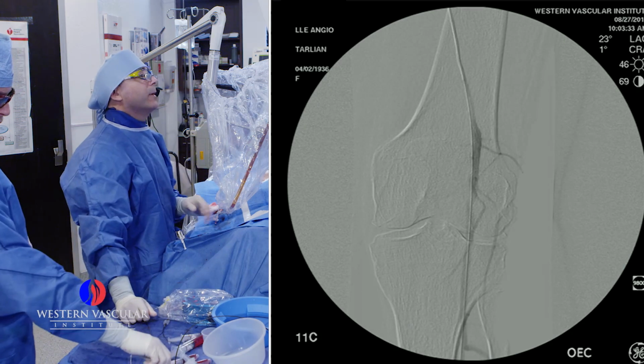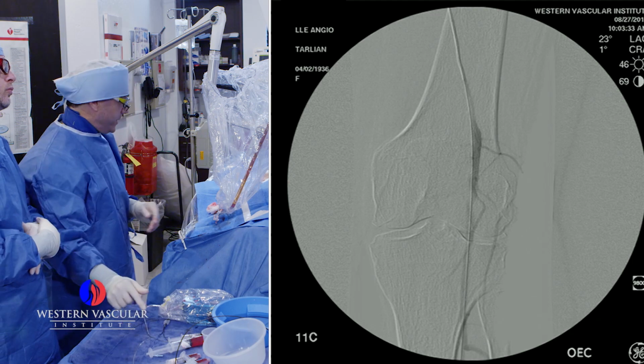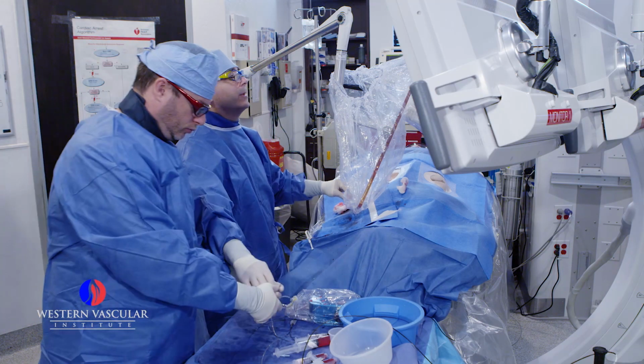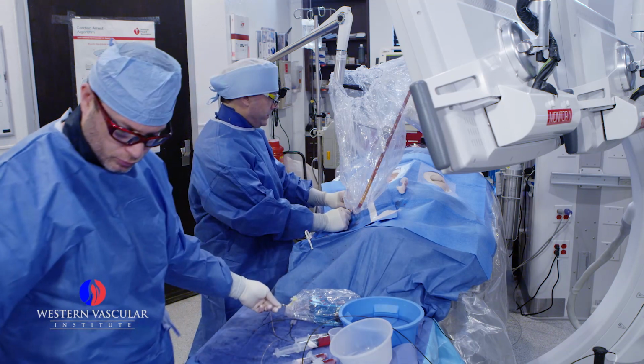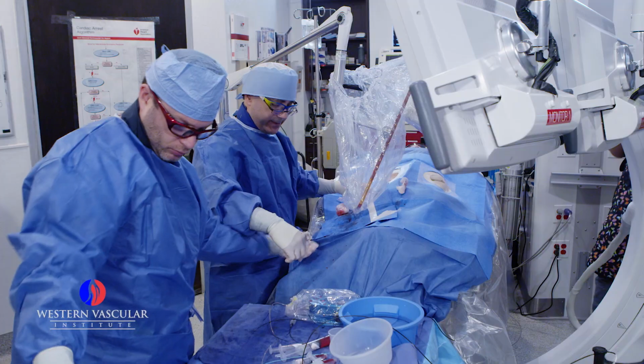We're going to touch this up. You can see that the opening is a little bit wider now after using the laser. So we're going to take this catheter out, leaving the wire in place, and then we're going to dilate this with a balloon. We use laser primarily for cost. It's very cost effective at what it does.